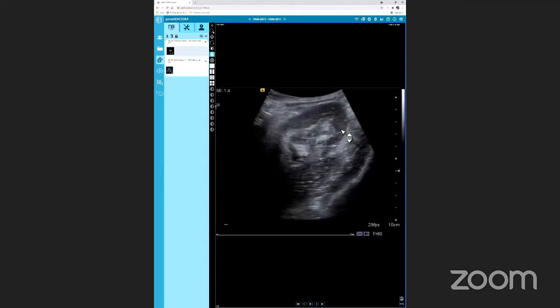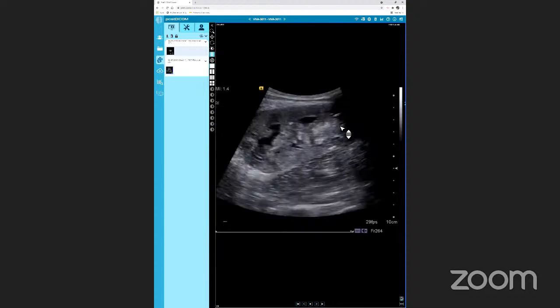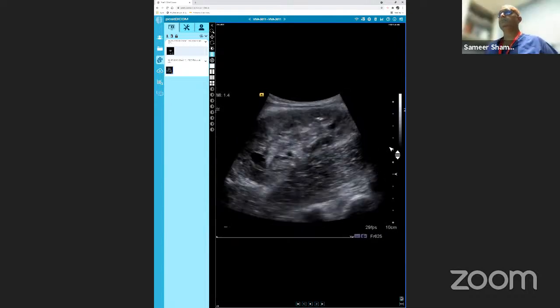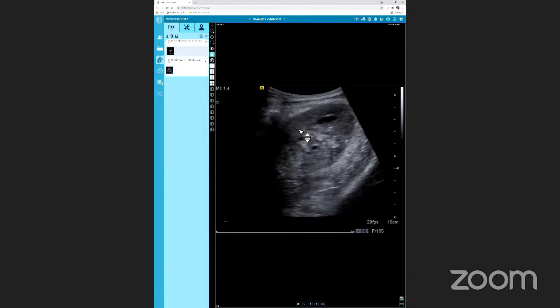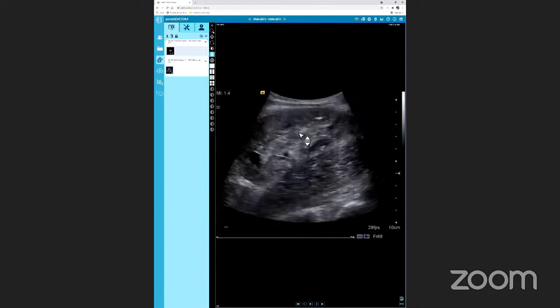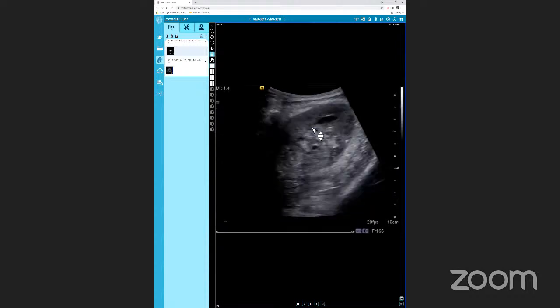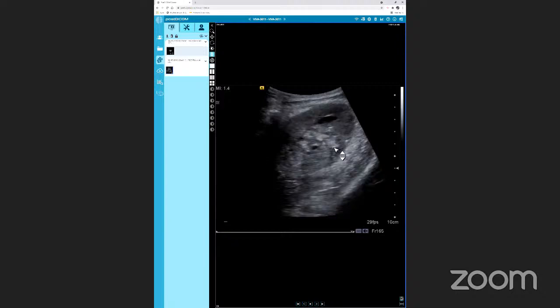This is an ultrasound of the kidneys, and it's not labeled. I'm not entirely sure which kidney I'm looking at, but this looks like the psoas muscle, so I'm guessing this is a native kidney. It's a transplant kidney. Okay, so these are all just the transplanted kidneys. Just looking at the kidney itself, it seems to have generally well-maintained corticomedullary differentiation. Just on this image here, there are some echogenic foci, which look more in the cortex.